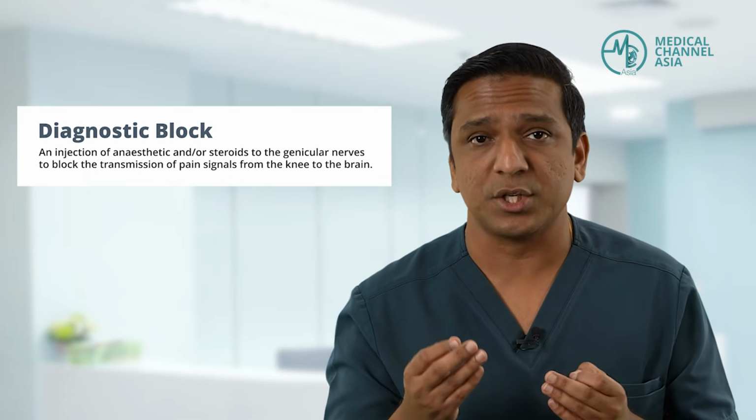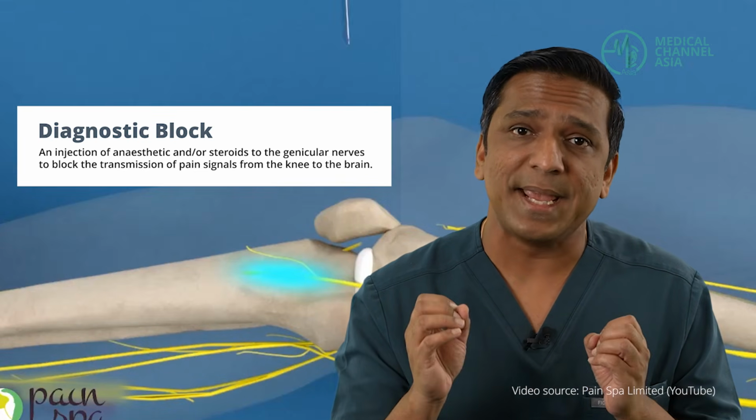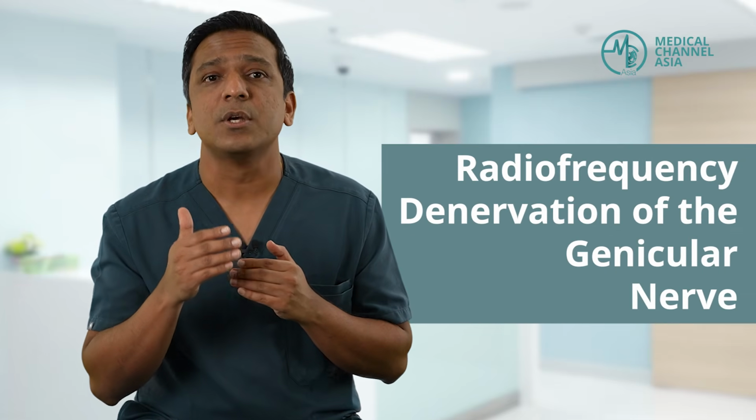Generally, patients get a diagnostic block first. A diagnostic block is defined as an injection with local anesthetic and using steroids to reduce the pain and inflammation coming from the nerves. Once the patients have a positive diagnostic test, patients can then be deemed suitable to undergo the radiofrequency denervation of the genicular nerves. So for this gentleman, we did this procedure as a day surgery procedure, and he had significant pain relief after the procedure and he went home the same day.